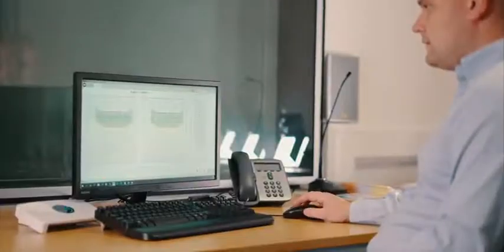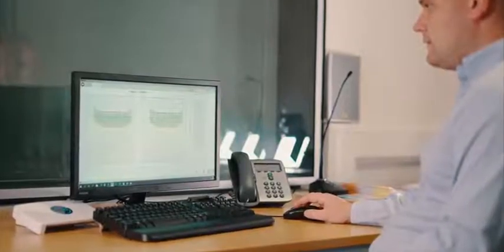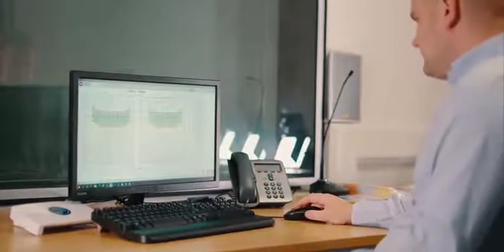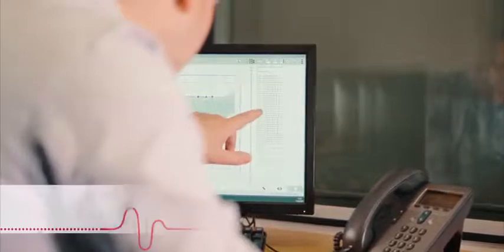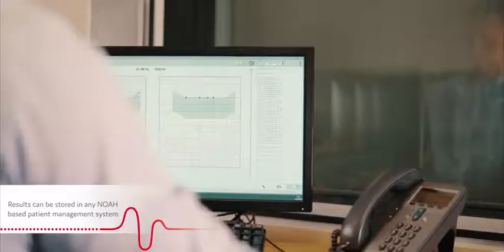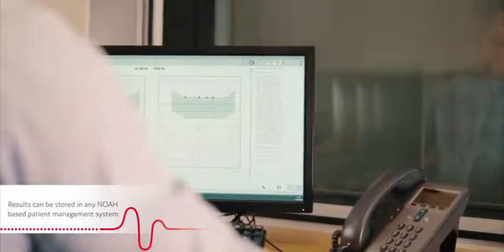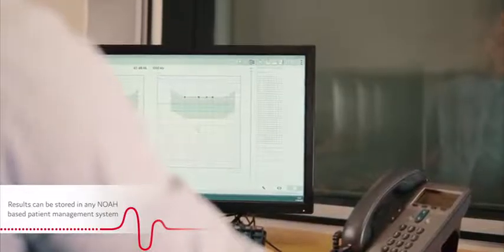When testing is complete, the results automatically transfer over to our studio software for review. They can be stored in any NOAH based patient management system.